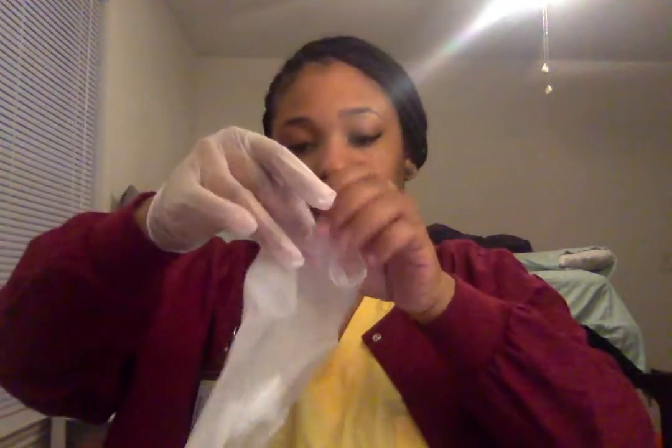Okay, I performed my hand hygiene, and first today we're going to be doing the intradermal injection, which today is going to be a PPD, which is just a TB test.